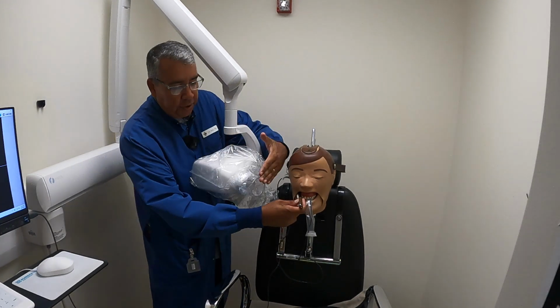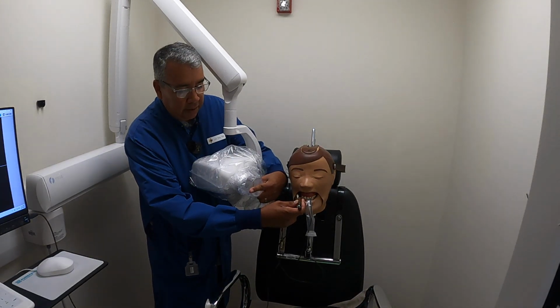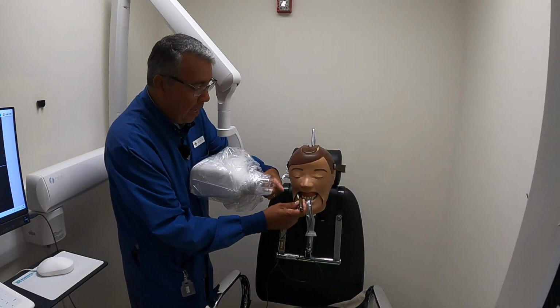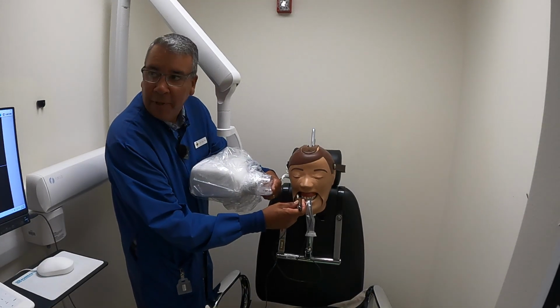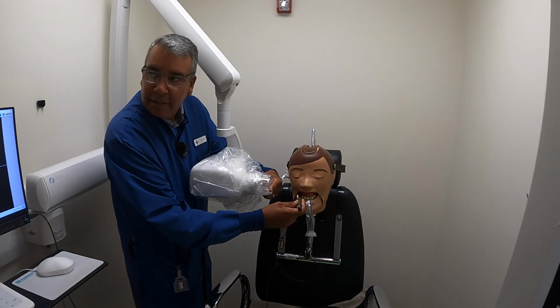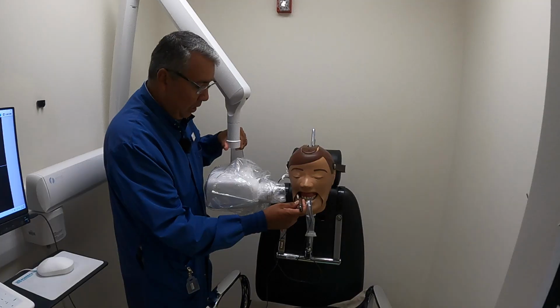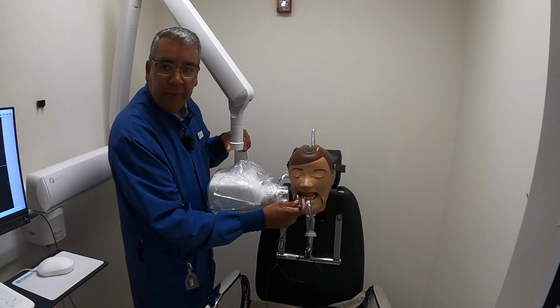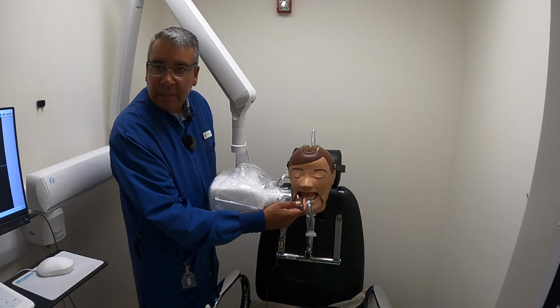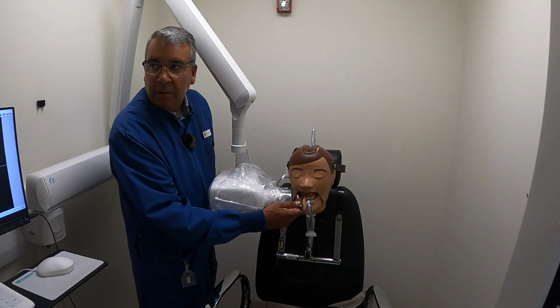The flat portion of this PID, if you had a pen going in the same horizontal manner, you're going to rotate it to where that pen is parallel with the horizontal angle of those premolars. Did that make sense? That is the horizontal angle. I feel like I'm there. Now, I'm only doing one thing. Look at how far forward I am. Do I care? At this point, no. All I'm trying to do is establish my horizontal.